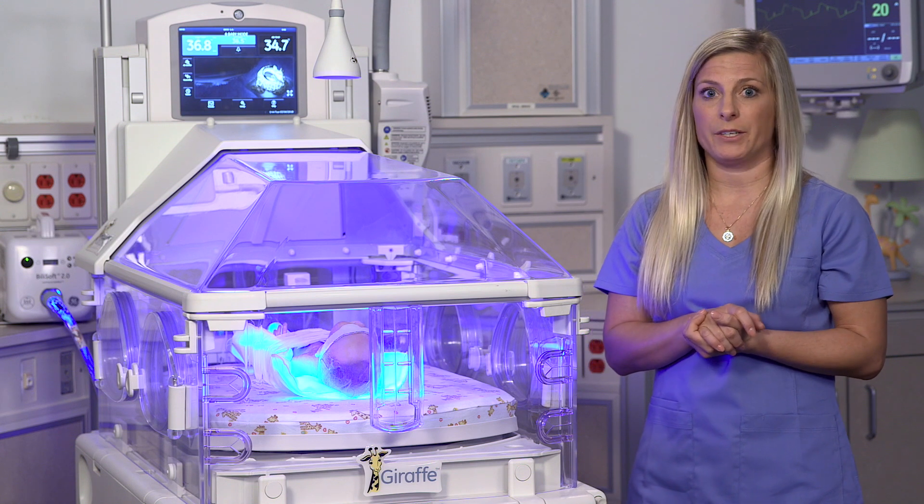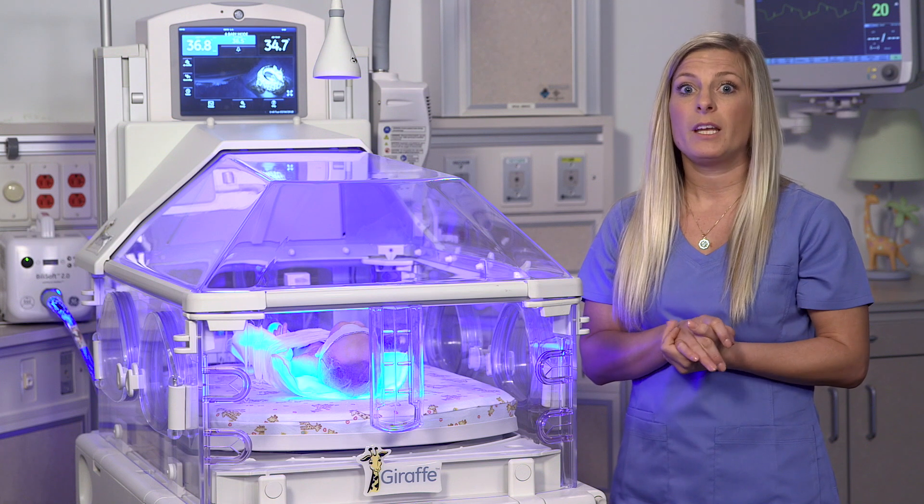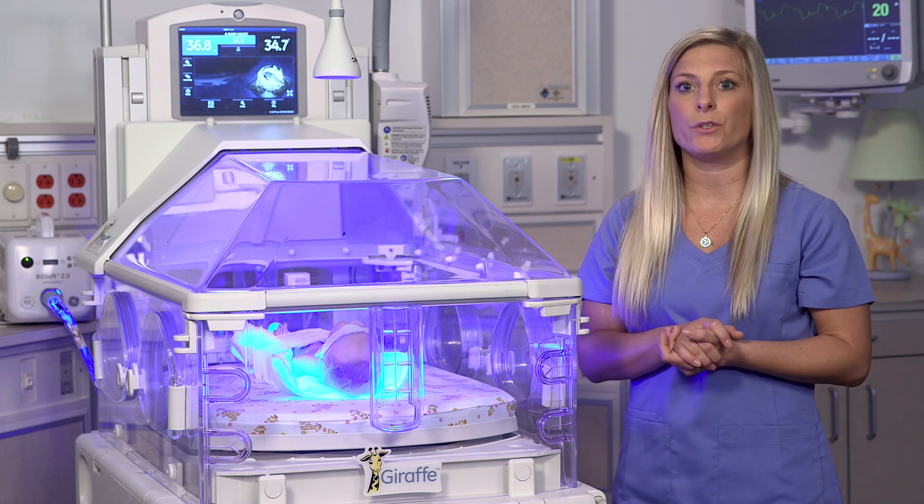You'll need to install new batteries if the display window is blank or a battery mark will appear above the measured value. If you continue to use the instrument, the mark will start to blink and measurement will no longer be possible.